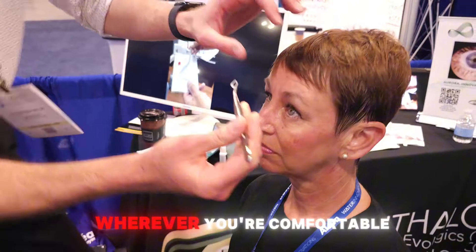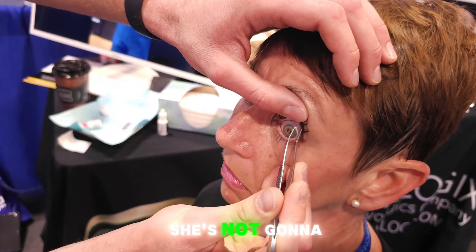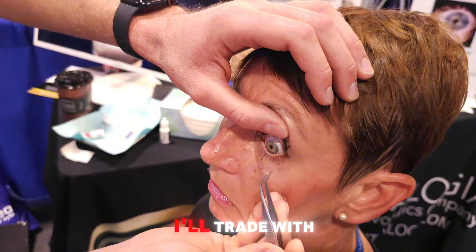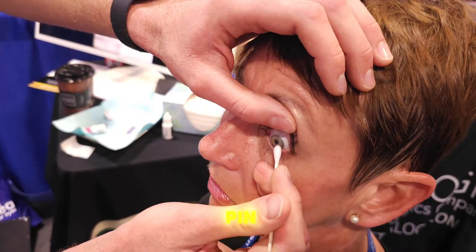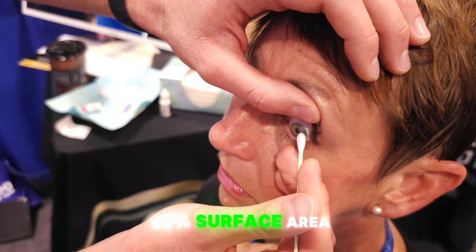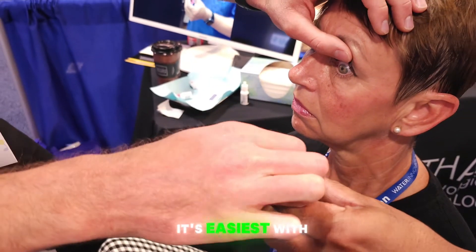You can position yourself wherever you're comfortable — typically I'm face-to-face with the patient. She's a good patient and won't move her lower lid, but most folks you'd want to hold their upper and lower lid. Just like a little rolling pin — gently rolling it onto the eye. It's more rolling than pressing, because pressing you might get 50-60% surface area contact, but rolling you can get 100%.